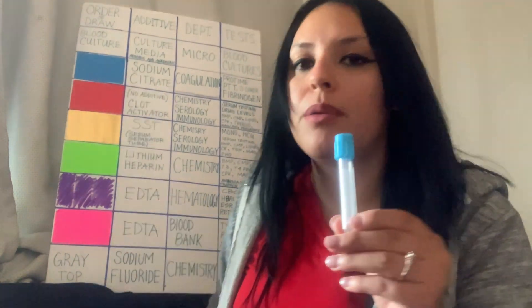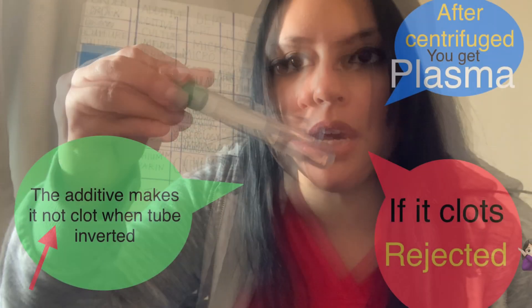This is a green top — you can hardly tell, but the additive is in there. Sometimes it looks like it's sprayed on the tube. This is the actual blue top, and the additive is more noticeable here. I want you to look at it — it has an additive in it even if you can barely tell.